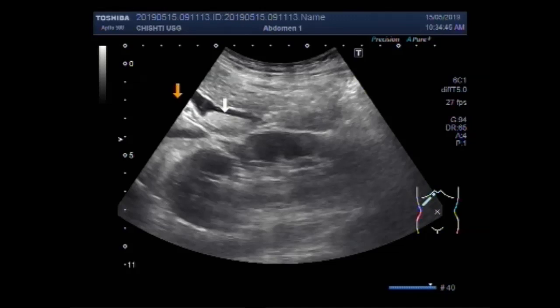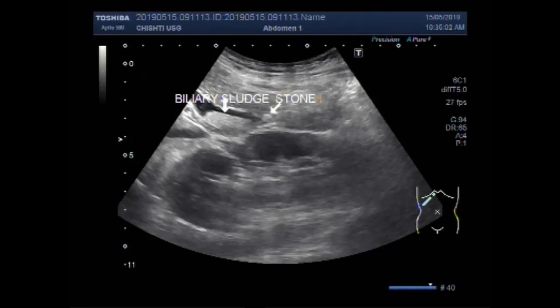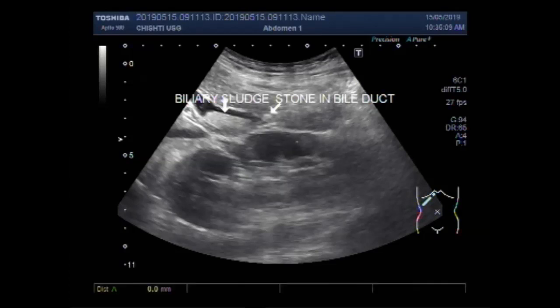This is the biliary sludge in the proximal portion of the bile duct. And this one is a small stone in the bile duct. The stone measures about 6.4 mm — the stone in the bile duct.